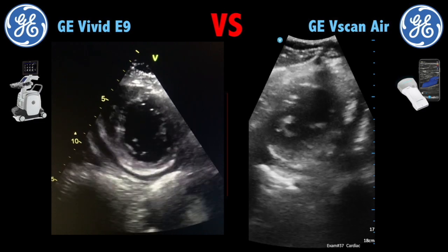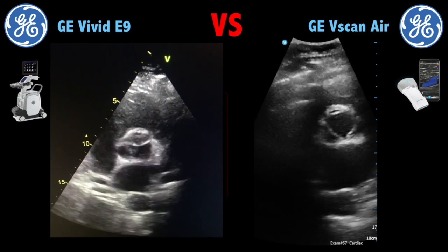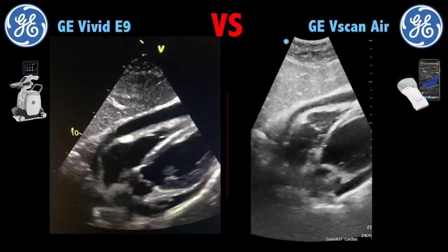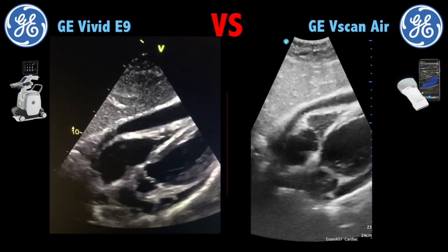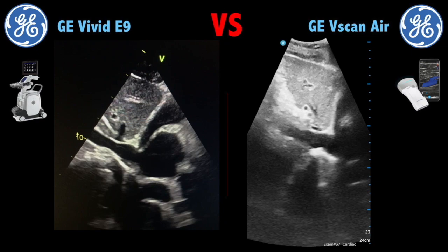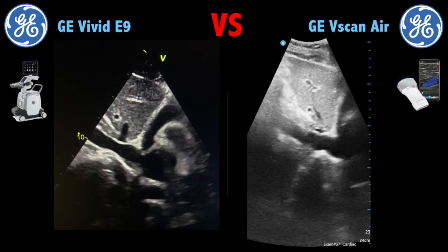Here the image quality is better on the VBIT-E9, I think due to the footprint. Here is the parasternal short axis seeing the aortic valve. And this is a sub-costal image — again, you can see the black lines, meaning free fluid in the pericardium. And this is an inferior vena cava image. I think the VBIT-E9 view was on inspiration.